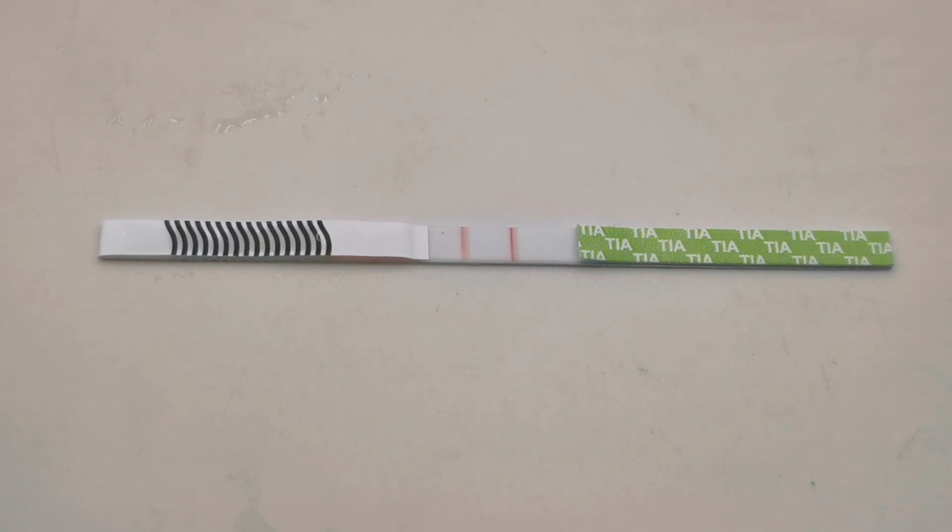But as we mentioned earlier, negative tests tend to develop much quicker than that, and as long as you've got a clear control and test line showing at 2, 3, 4 or 5 minutes, you can interpret that as a clear negative result and move on to a following test. The test line will not disappear later if it's left for a long period of time. Do not interpret any lines forming beyond 10 minutes. That is the correct and absolute read time for a positive test result.